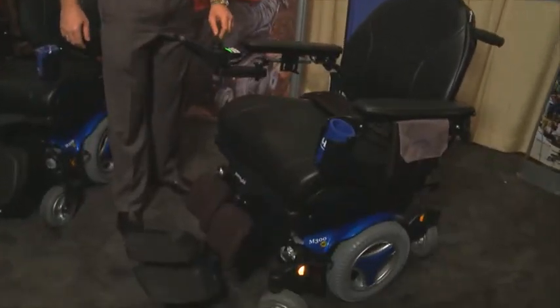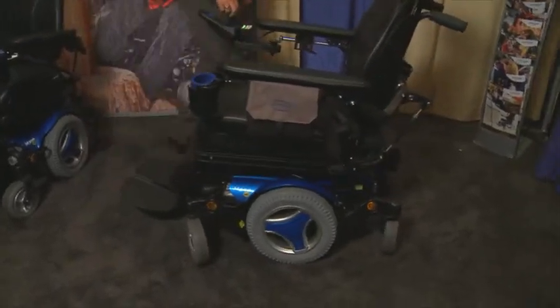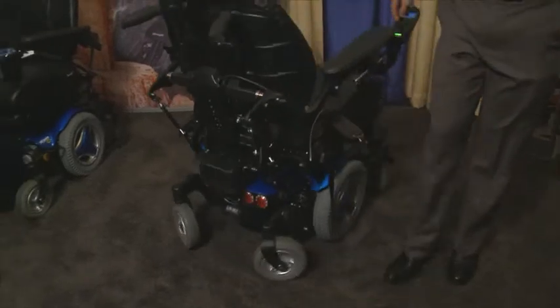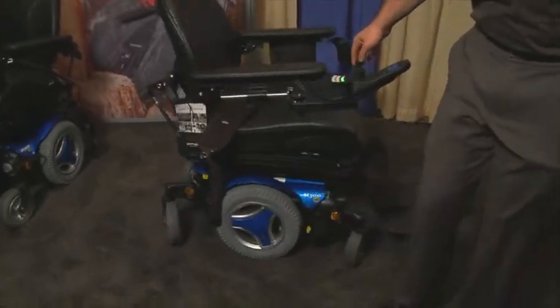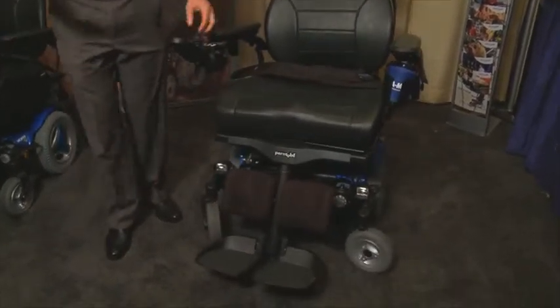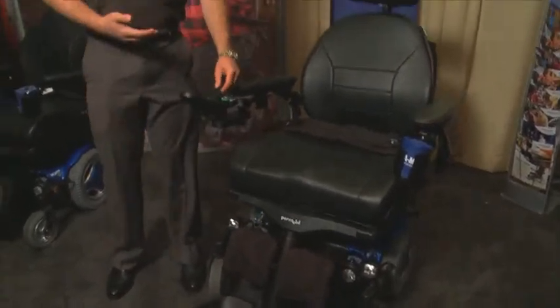So what I want to do first is spin this chair around so you can take a look at it. This chair has power tilt, power recline, and power leg elevation, but you don't see a lot of boxes and cables exposed, and so what that does is it just cleans up the look of the chair. Aesthetically this chair looks good, and what you have to realize about any power wheelchair, any mobility device, is that people want to look good.